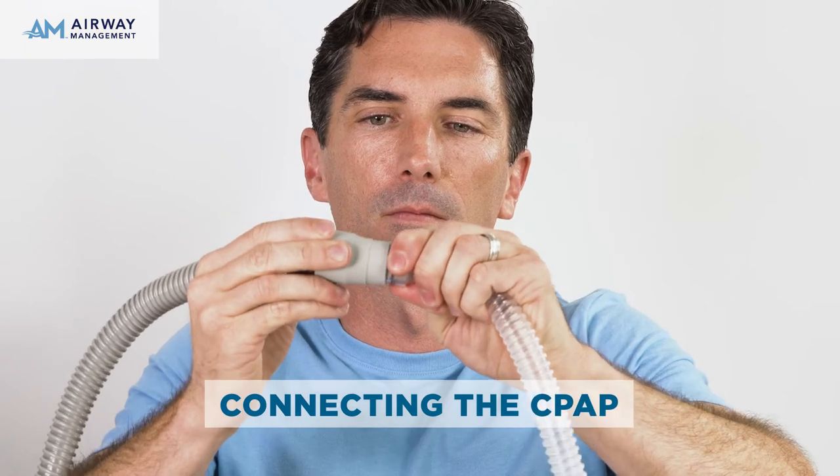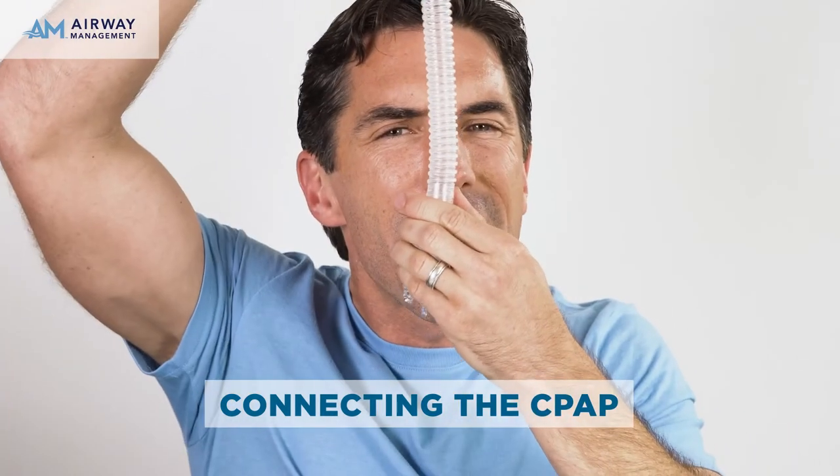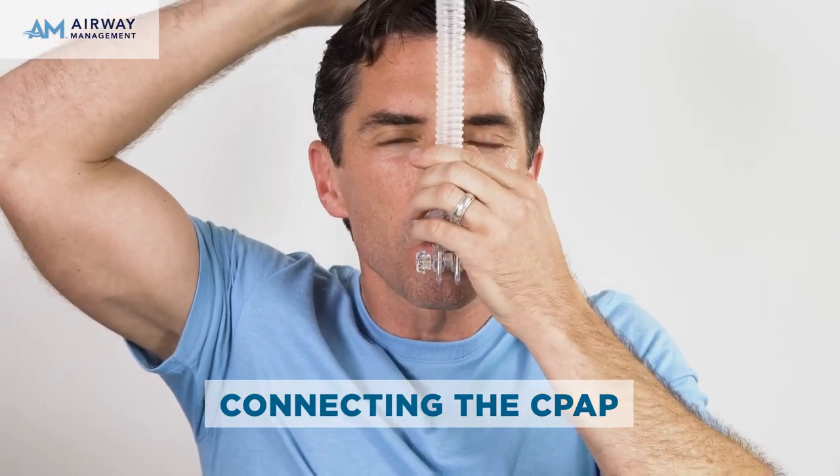Attach the CPAP tubing to the swivel connector and turn on the machine. Feel around the pillows for any leaks and adjust as necessary by loosening the nut and moving the mask. If you have an air leak, recheck the size of your seal and change sizes as needed.